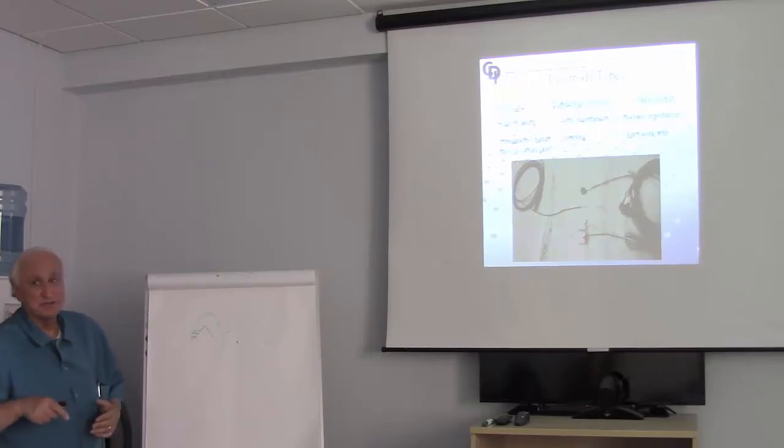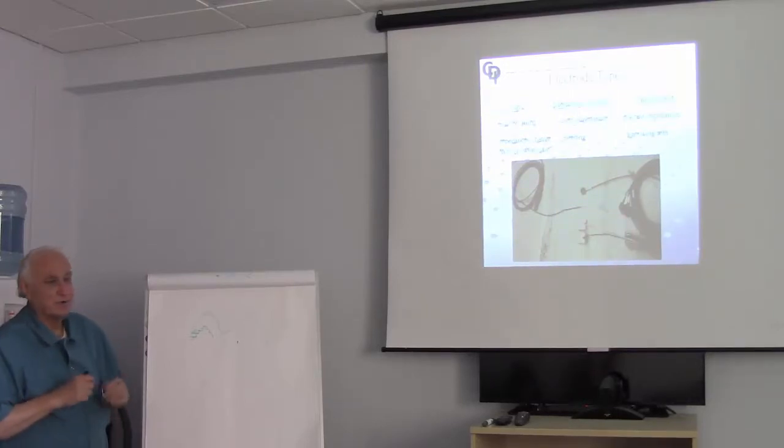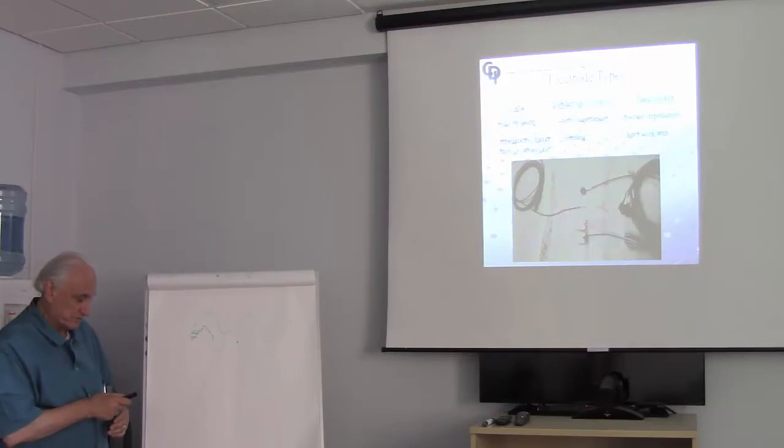On the case we looked at this morning, they used EMG recording electrodes, which are, I think they were 2.8 centimeters long and a very fine wire. Those are fine for short cases. For longer cases, I don't think they work the best. And we will talk about that some more to try to come up with a way to figure out what the best thing to do is.